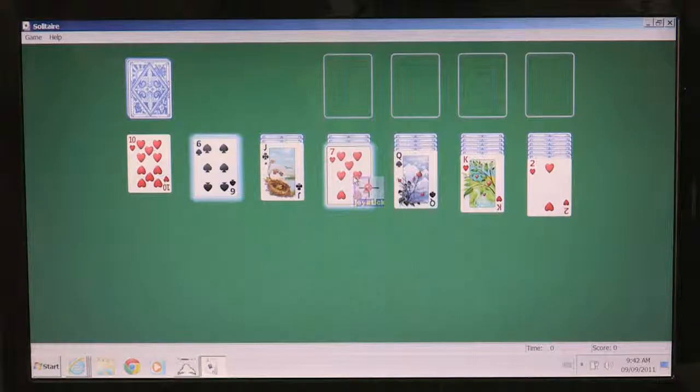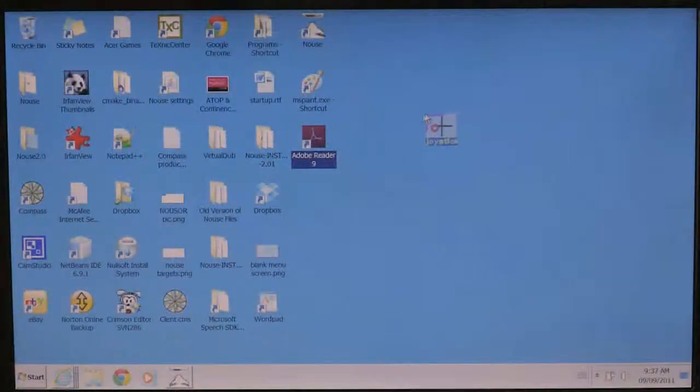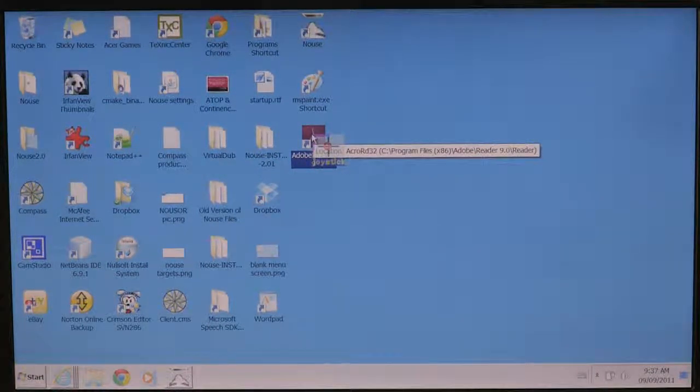Pointing to an item on the screen means moving your Nouse cursor so the pointer, or the top left-hand corner, appears to be touching the item. When you point to something, a small box often appears that describes the item. Second is the red circle component. This component is used to display where the tip of the user's nose is located.